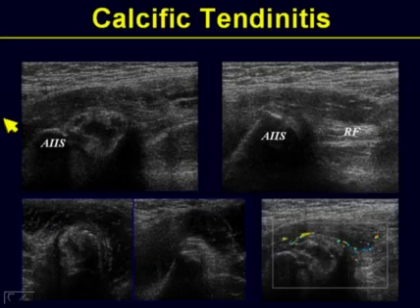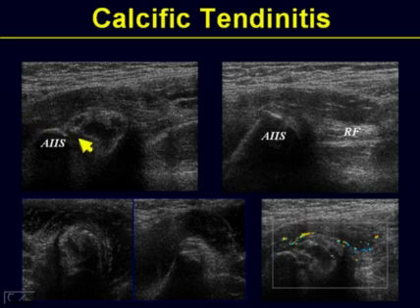In chronic disease or avulsion injuries, this is what could appear. Let's first look at the asymptomatic side. On the right-hand side, you see the anterior inferior iliac spine, where the origin of the rectus femoris is. And if you jump to the affected side, you will clearly note that there is asymmetry or a lot more traffic on the affected side.